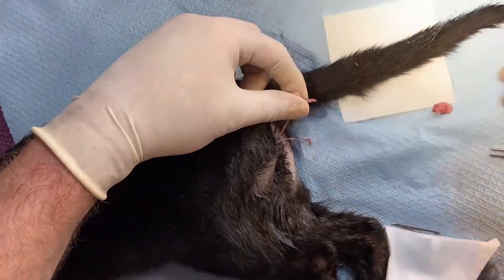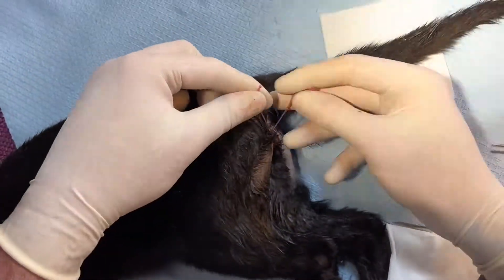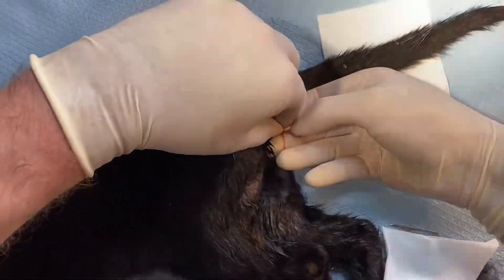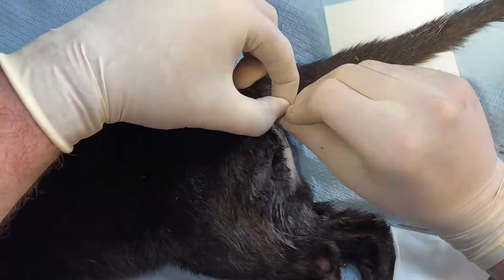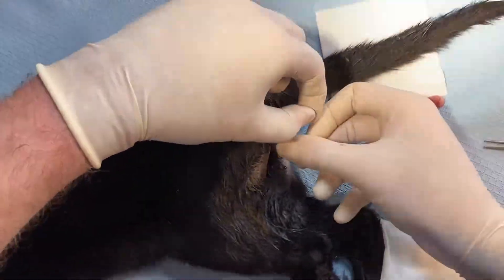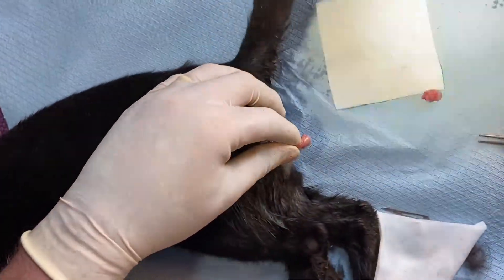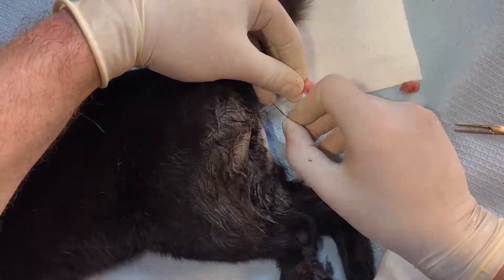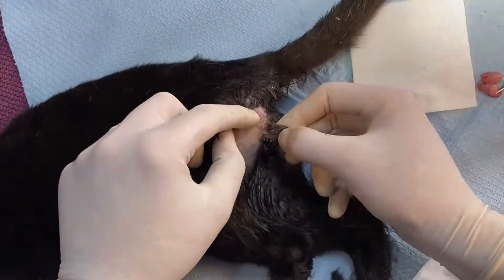Let's go back to how we were and do one more. Now you can see them all stacked up — make the incision about a centimetre past the last knot and check everything's okay.